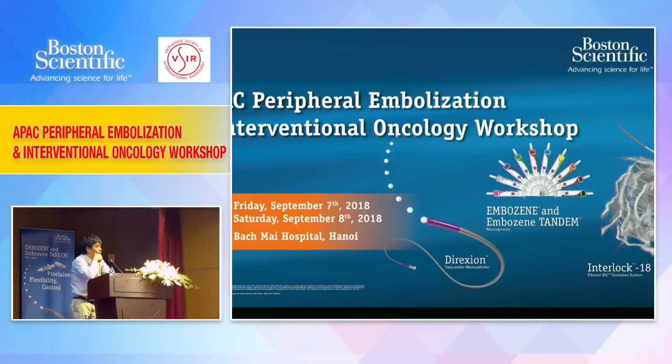And not infrequently, if you put them on some tranexamic acid or vitamin K, correct the coagulopathy, and give some plasma, they do settle down. One thing I also learned from our experience is that earlier we were mentioning cordyceps and anticoagulants. Here you try to stop bleeding, while there they consume these to stimulate more bleeding. So these are various compounding clinical factors we have to look into before you whack the kidney with gelfoam.